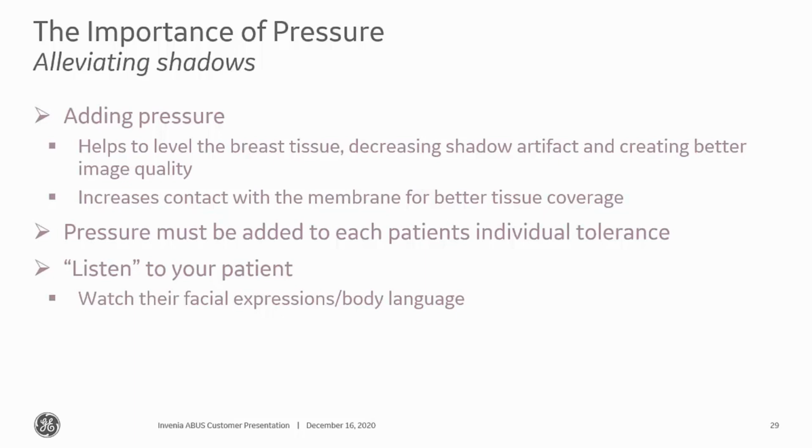But I also emphasize at the beginning in my talk track that we use the pressure for two reasons: better image quality and better tissue coverage. And a lot of times I think that sets in their mind that, okay, that is important, I can tolerate this, and they're pretty flexible and pretty compliant.